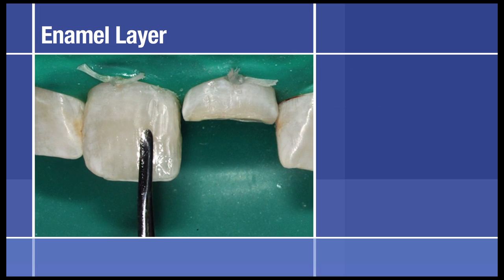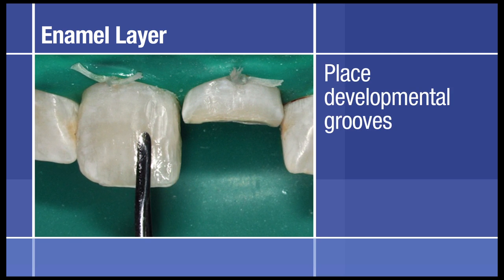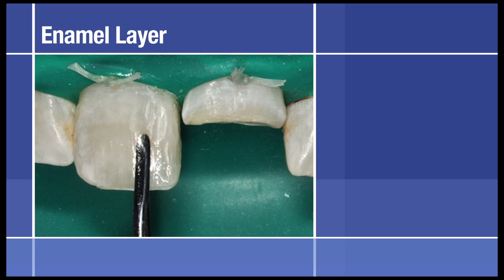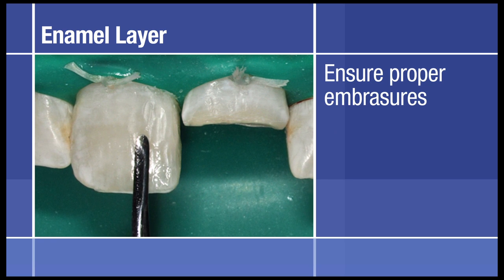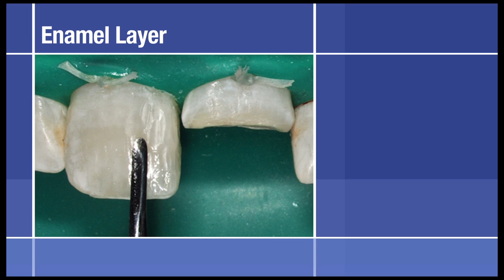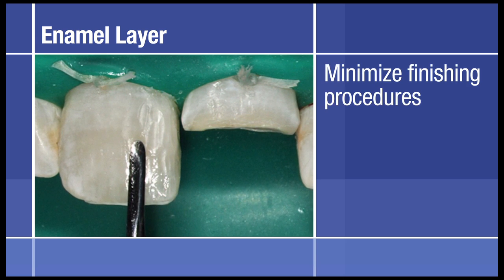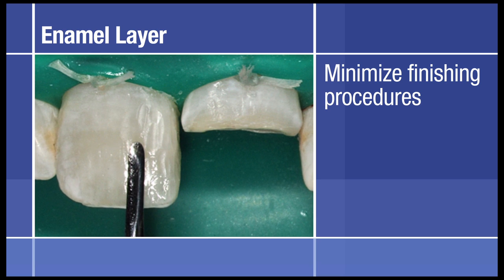So care must be taken here to start placing developmental grooves, to have the proper embrasures as well. With an IPC instrument, with any type of contouring instrument, we need to make sure we have a nice final contour to minimize finishing procedures as much as possible.